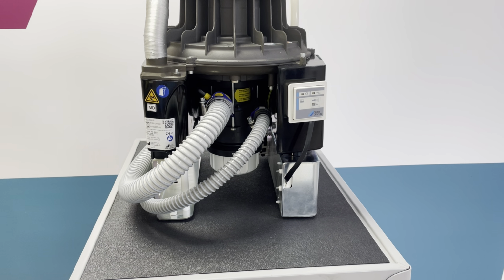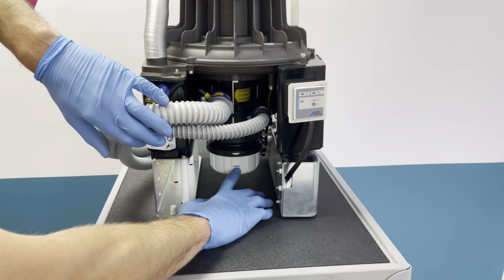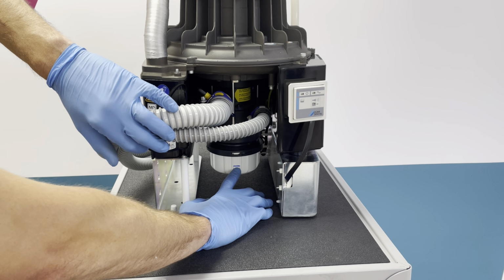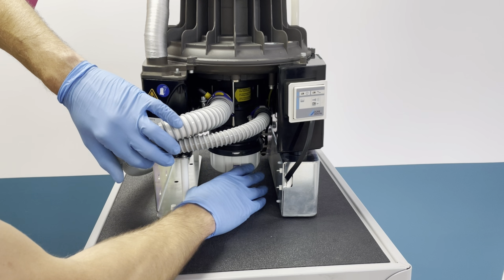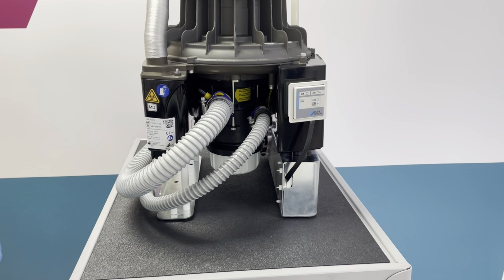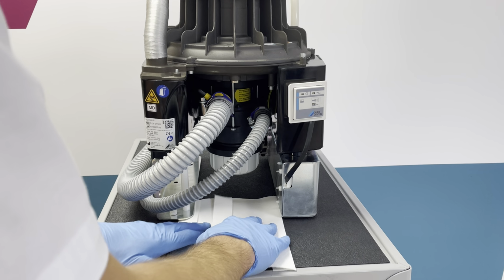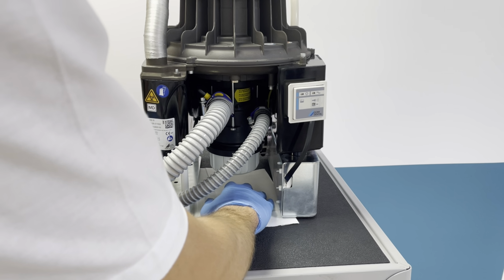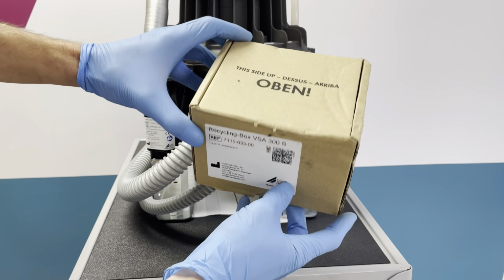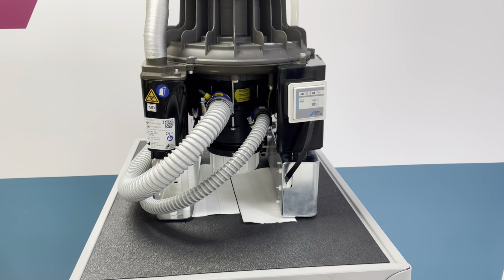So as you can see, I've put a little blue line there, so that will be the level that you're expecting to see the amalgam sediment, and the pot will be pretty much 90% full of water. So with gloves, face mask, apron, get some tissue because there might be a little bit of spillage. You need to replace the pot with a new one every time.